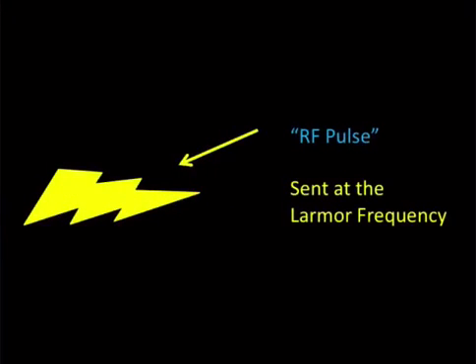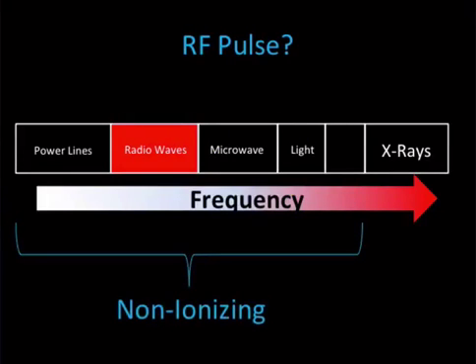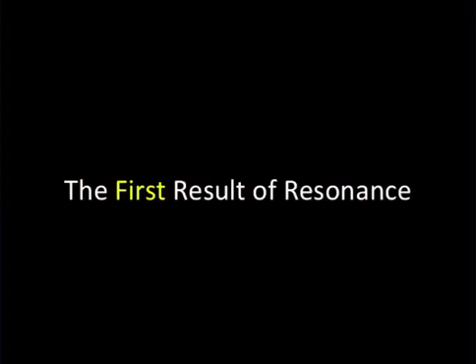So what is an RF pulse? It's basically a radio wave. Now remember that these kinds of waves are non-ionizing. You're not getting ionizing until you get all the way over into this kind of bandwidth.